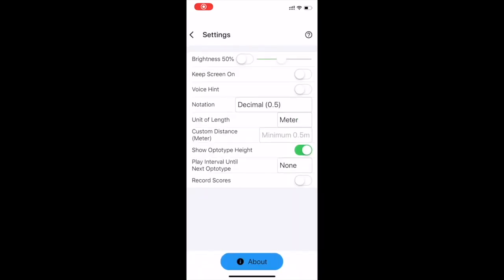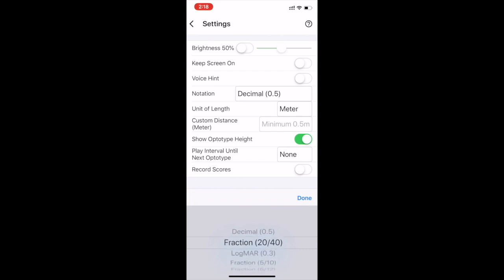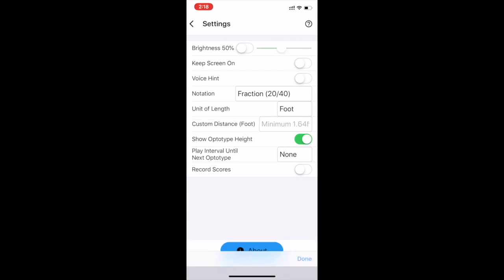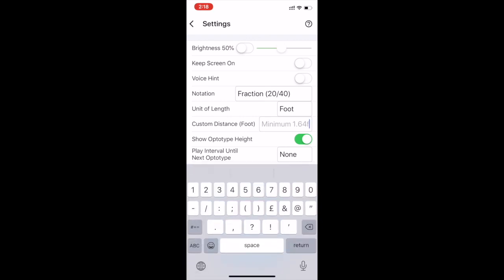Once the app is open, press the Settings button at the top right of the screen. In Settings, the 4th option down, change notation from decimal to fraction, then change units of length from meter to foot, then in the Custom Distance box type 10. Lastly, enable the Record Scores option and press OK.